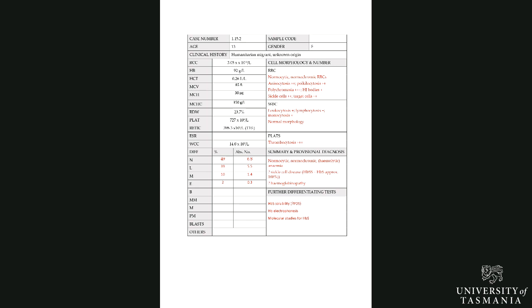The Howell-Jolly bodies suggest to us that the spleen has been affected by the sickling, and usually the spleen is the first organ in the body that shows the effects of sickle cells. Often we get a condition called autosplenectomy, which is the answer to the question below this case study. So the Howell-Jolly bodies suggest that this person has either had a splenectomy or her spleen is not functioning.